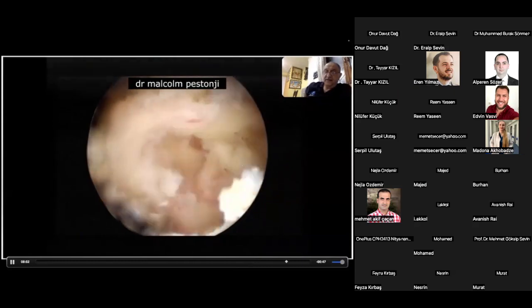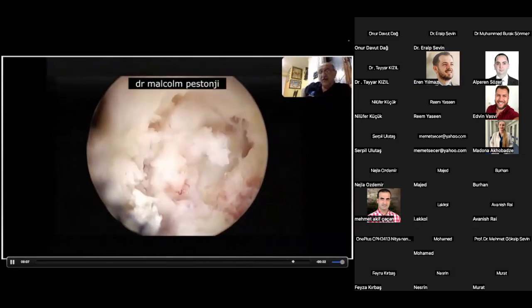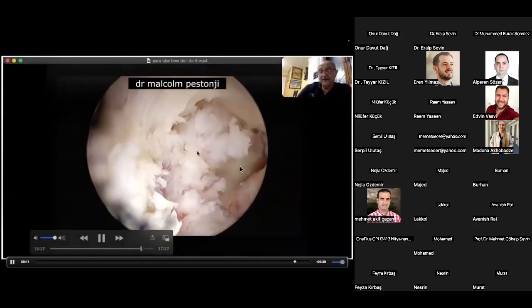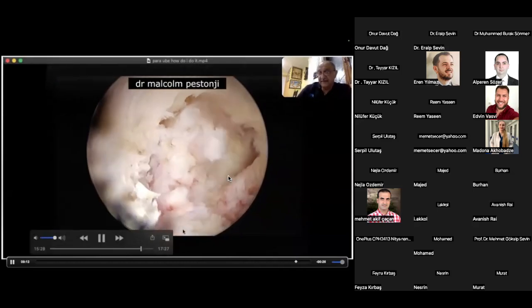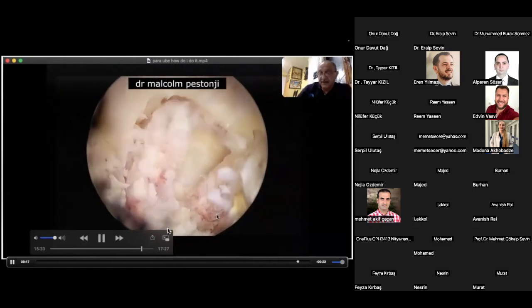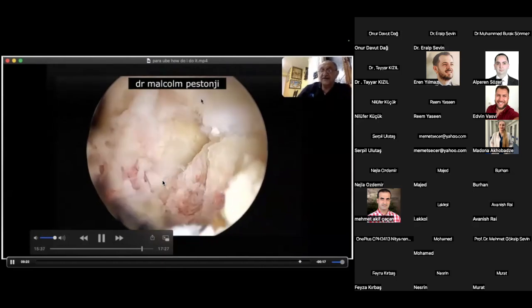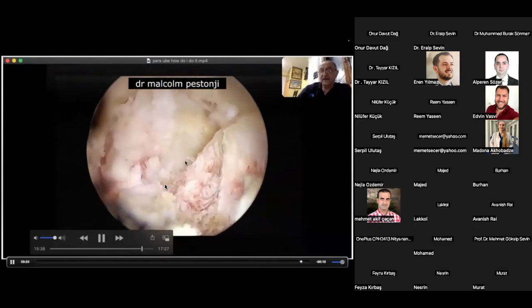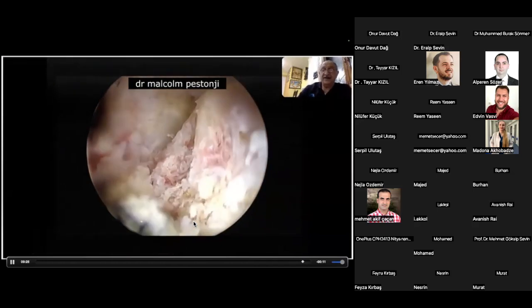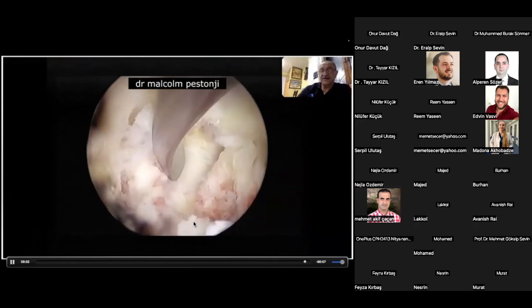And at the end of the whole thing, you can see nicely an opened up foramen, tags of the nerve root, and the discal surface below. The white surface is the discal surface below. So part of the SAP cut, the exiting nerve root completely freed. That is the disc where you see this moving. So we have done a nice job in decompressing. So this is a Para-UBE. So I showed you 3 videos that deal with ventral facetectomy.